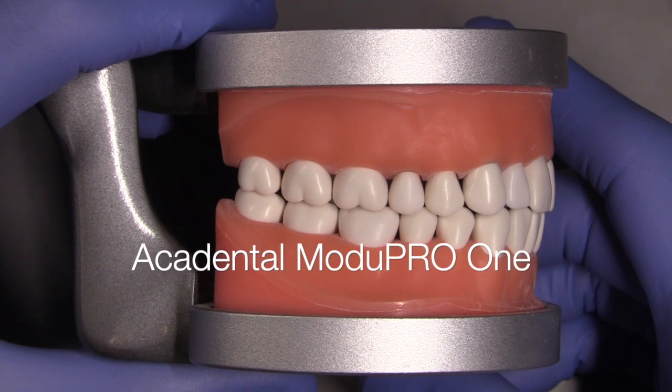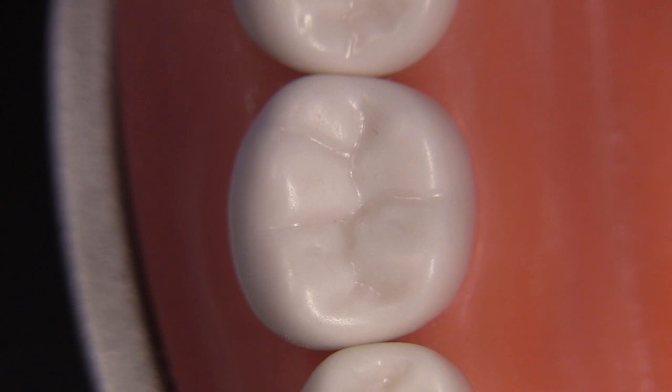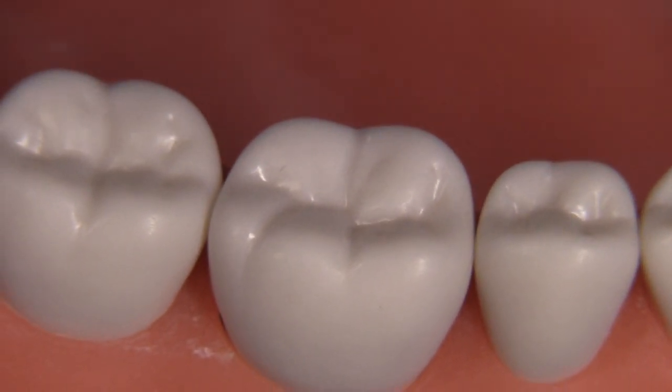I'm going to utilize the Acadental ModuPRO One typodont. It's a very popular typodont used by many testing agencies and also being used by several dental schools.